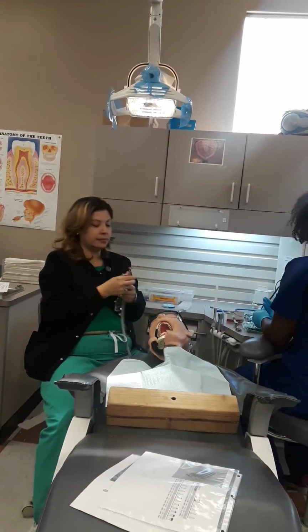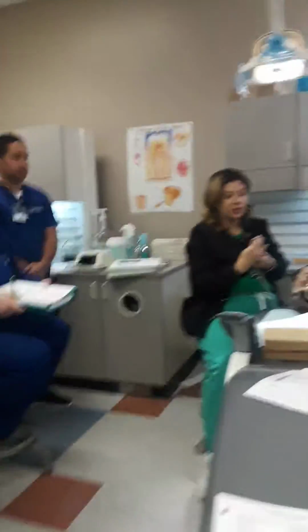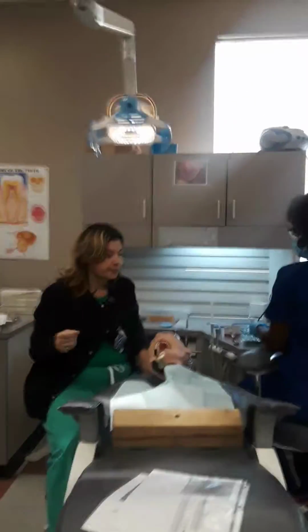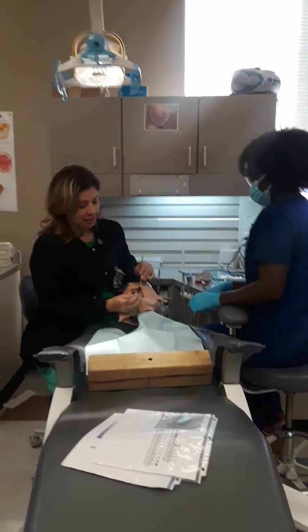Polishing points and cups. Okay. All right. So she's going to show you how to pass. When we break into teams, they'll break it down and you will be shown how to pass. So I'm a two-handed pass. This is my basic pass.